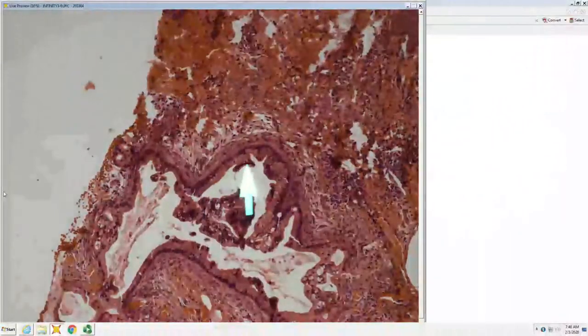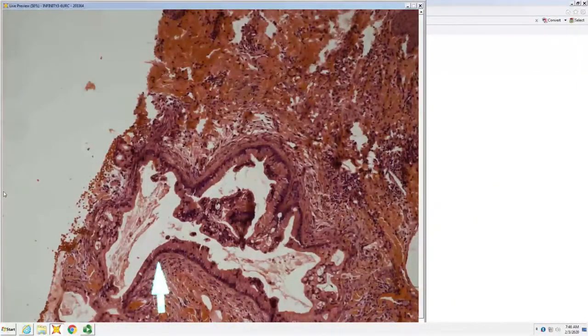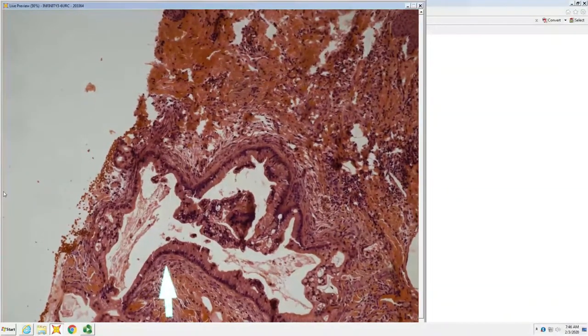This one looks to me very similar to gut carcinoma. It was, by history, a cholangiocarcinoma. Dan, you want to teach us any? I've seen some where you actually see bile, but what else would be a hint to cholangiocarcinoma? Somewhat bland. And the pigment sometimes can help you, but it's a tricky one, because of the blandness of the cytology sometimes to pick up. And again, patient history and imaging may be key.